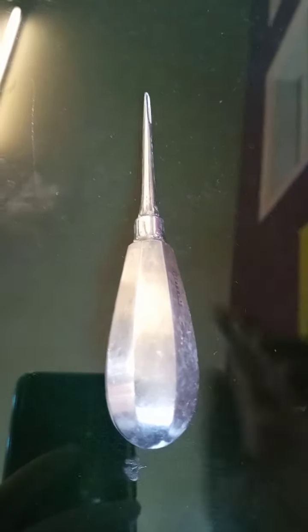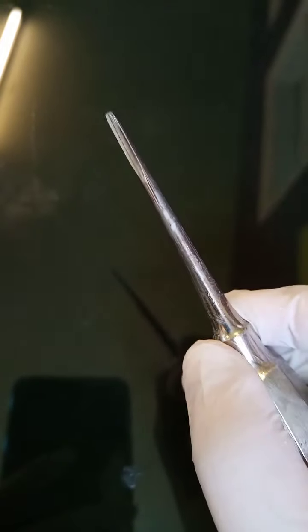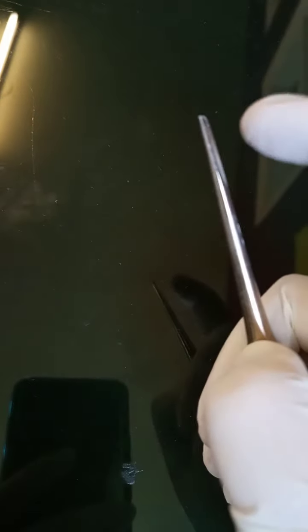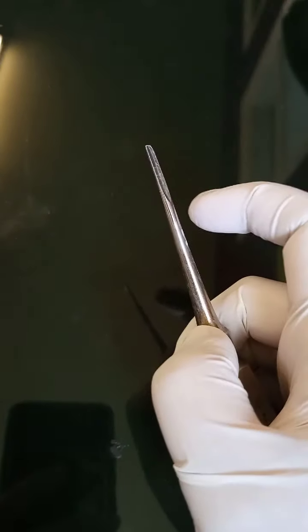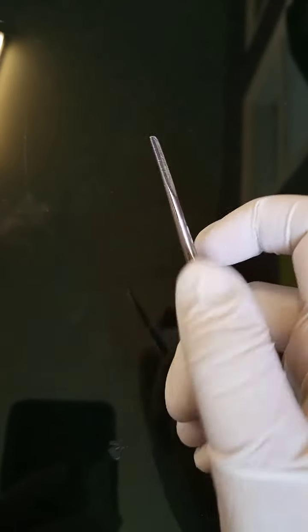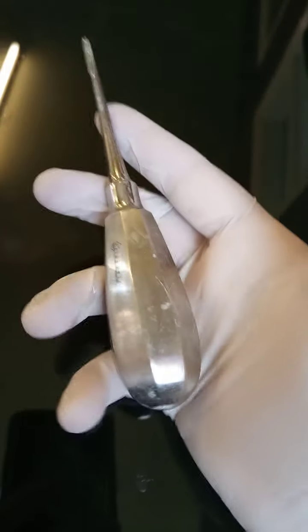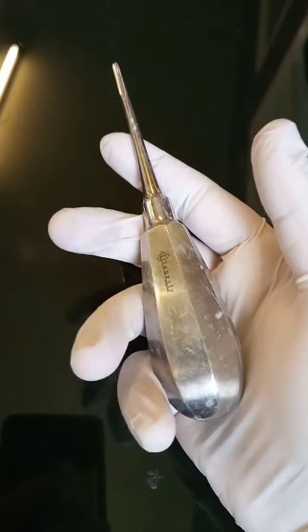This is called straight elevator. It also has three parts: blade, shank, and the handle. The blade portion is concave from the inside, and this side is usually kept towards the tooth being luxated. The blade portion is connected to the handle through the shank. It is usually held in the hand by using palm grip.